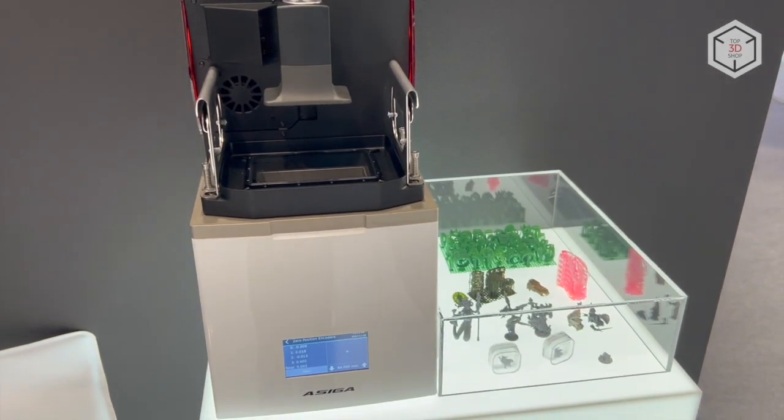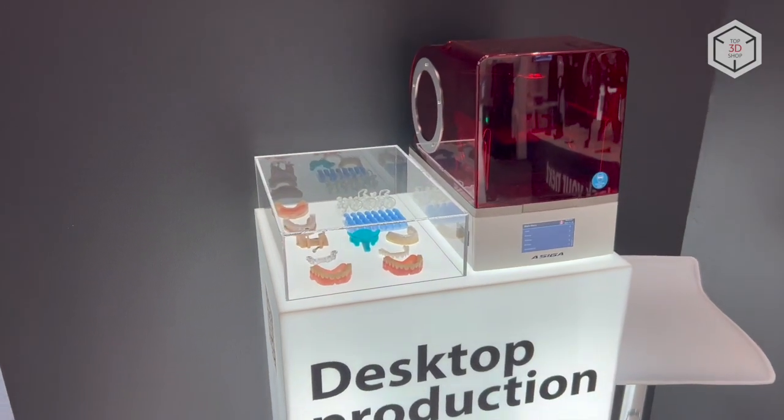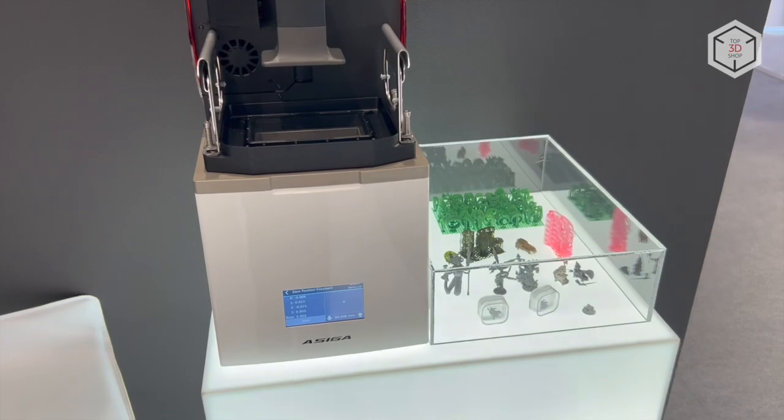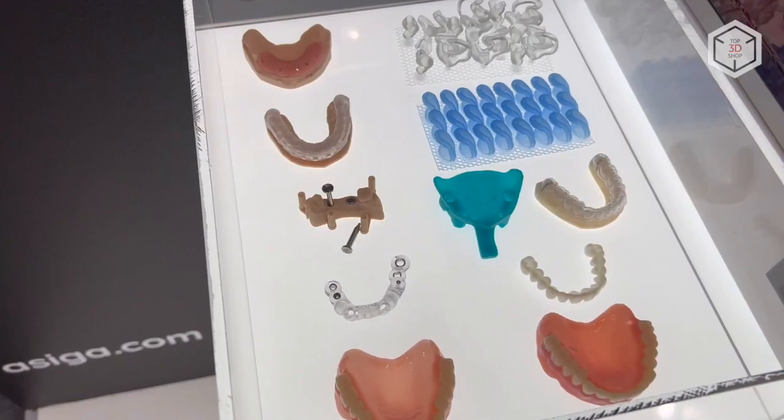Max, Pro4K, and Pro4K XL. The Max series of 3D printers consists of four devices — the basic model and three modifications of the Max X model — with the key difference between all the options being the minimum pixel size.